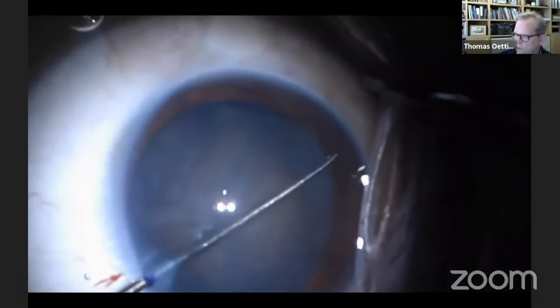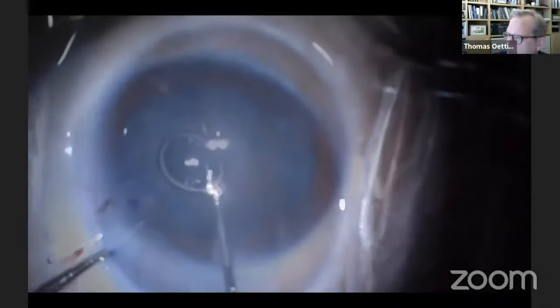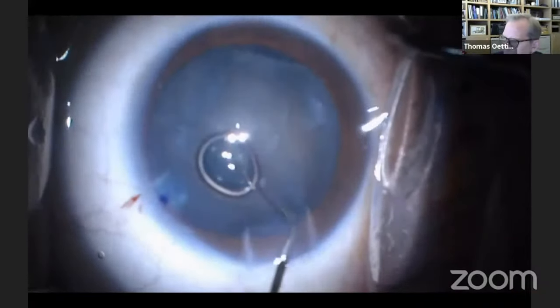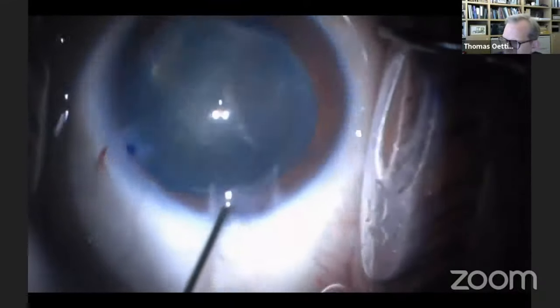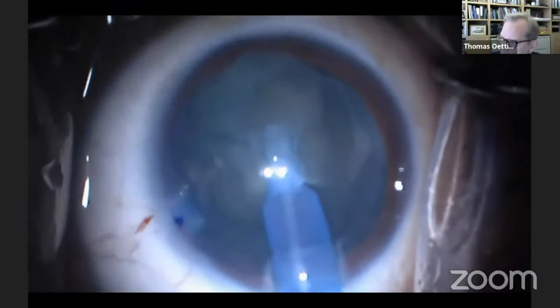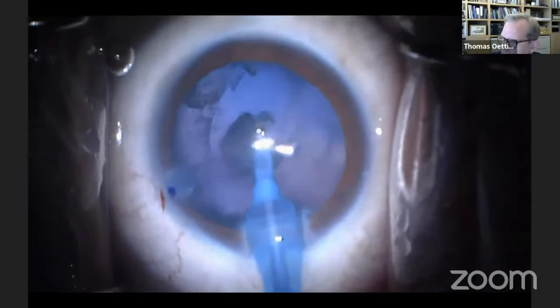The capsular tension ring is all the way out to the equator of the lens, but it's a long-standing defect there, and so the lens has a little dent in it, a little bite out of it. Oftentimes, these traumatic cases like this are very soft lenses, and one of the techniques that I like to use is just to prolapse the whole lens up with a bunch of hydrodissection and hydrodelineation. And then you can go in often with your IA unit underneath the soft lens and remove it. So these zonular problems are often associated with soft lenses.